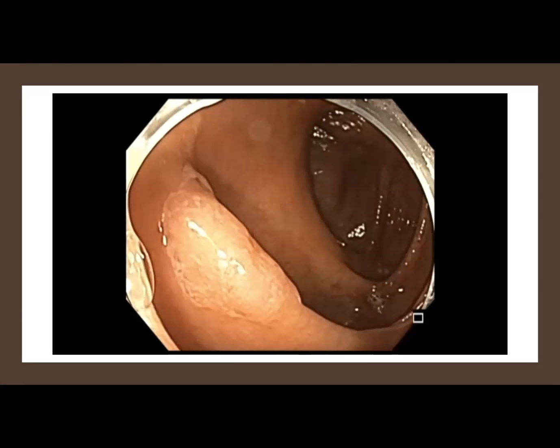The other thing is, as we are talking about the presence of dysplasia or not in a sessile serrated adenoma, one of the things I would like to comment on and hear from others is this: although people are suggesting that you could do cold snare resection, and it is very easy to resect sessile serrated adenomas with cold snare, there are two problems.